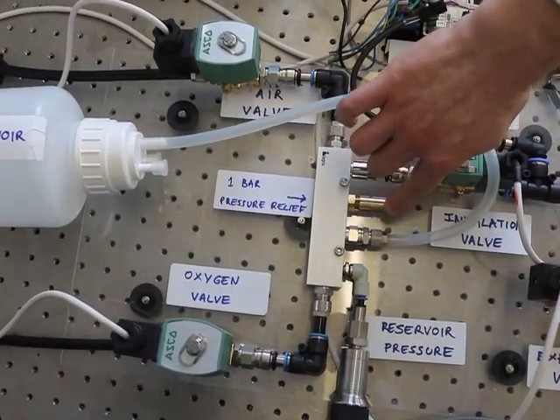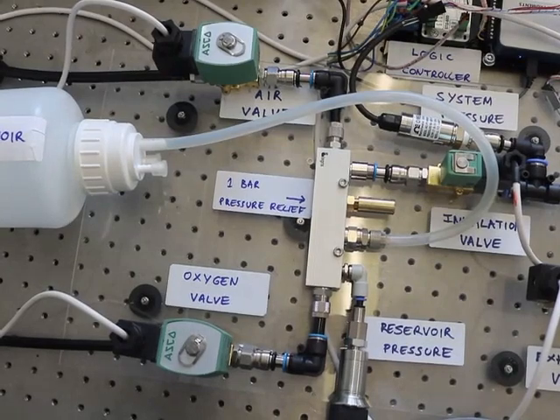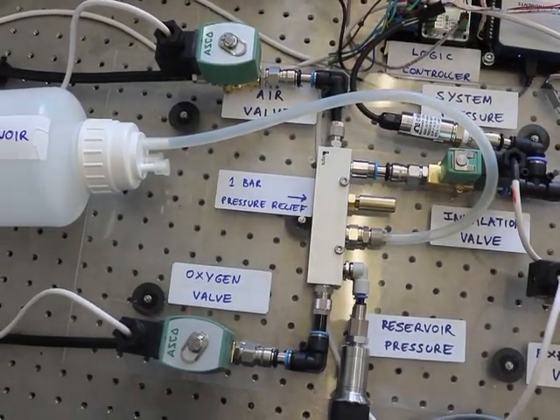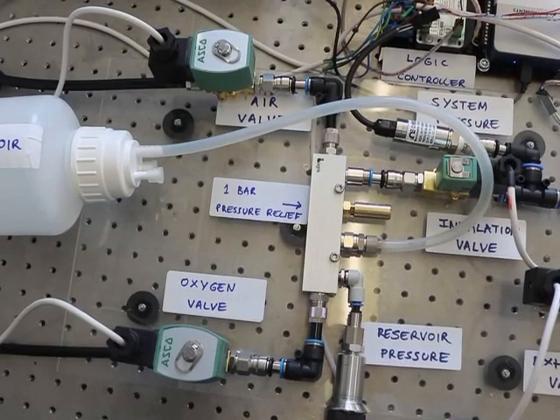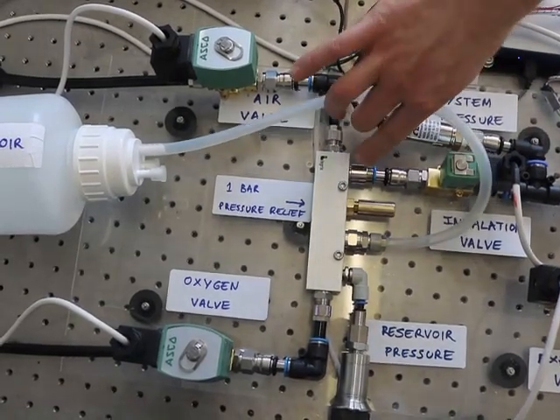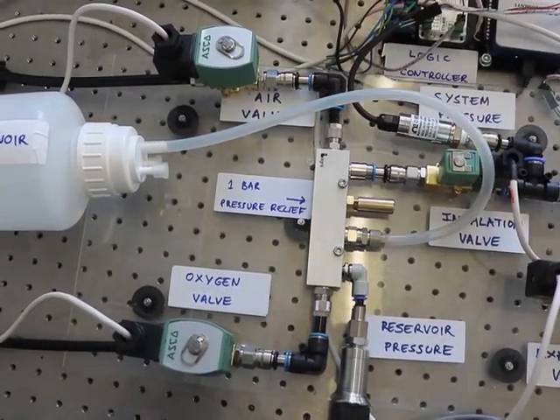And we have a safety feature here, which is a pressure relief valve. If the pressure in the reservoir exceeds one bar, that lets gas out, so that it will never exceed that value. And then here we have a connection to the inhalation pathway.